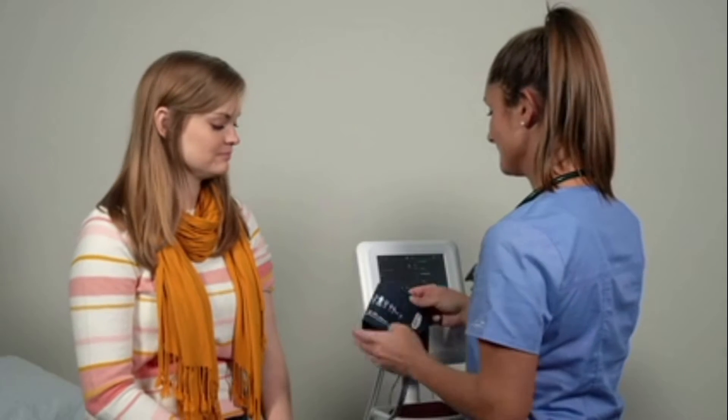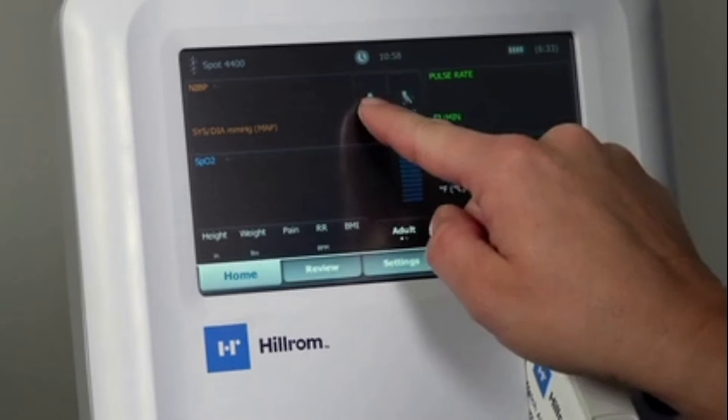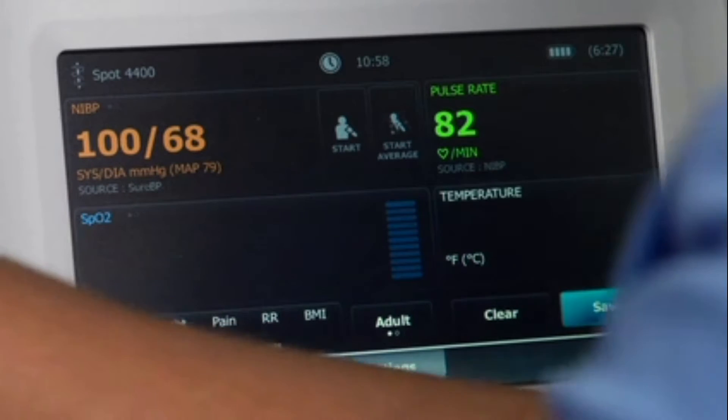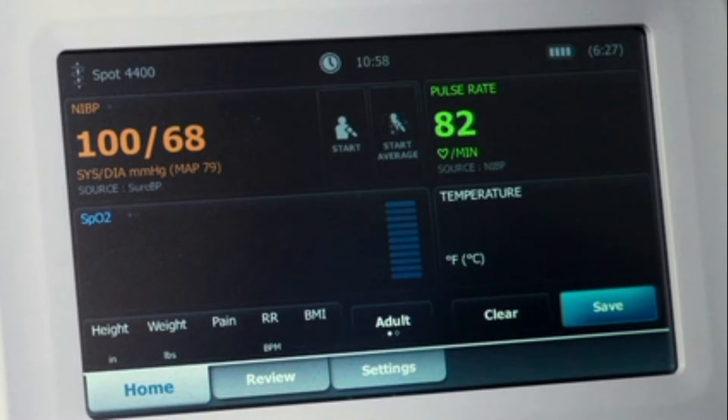Let's start an exam. Get ready to take a basic set of vitals. Touch Start to begin a one-time blood pressure reading using the Welch Allen Sure BP algorithm, which is proven to capture a BP reading in less than 15 seconds. A BP reading will populate in the orange NIBP tile when the reading is complete, and the source for the reading will also be identified to show how the reading was captured. Pulse rate will populate with a BP reading unless it is overridden by a pulse oximetry sensor.